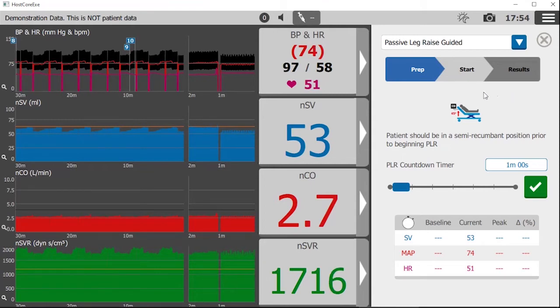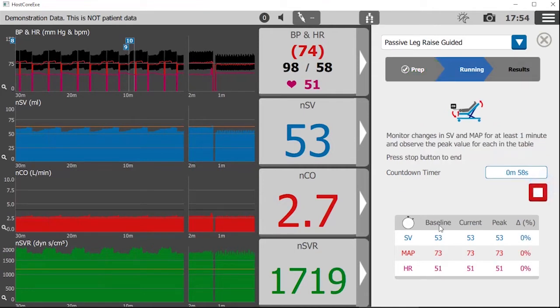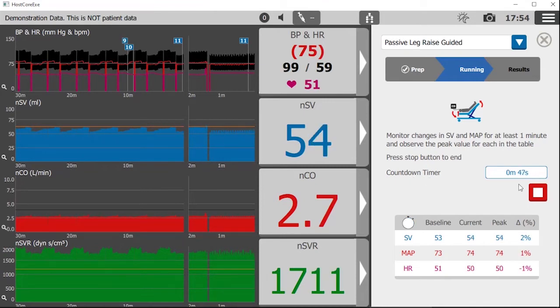Step 1: place the patient in a semi-recumbent position and set the timer. Step 2: press the arrow to capture the baseline and start the timer, then quickly change the patient's position as illustrated. Step 3: when the timer reaches zero, return the patient to their original position, then read the results.